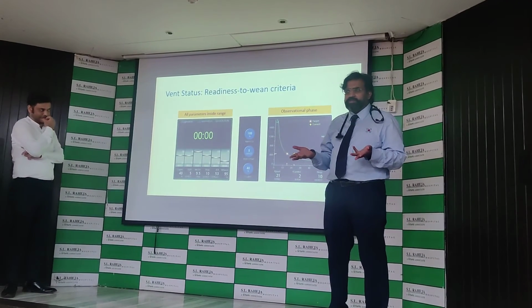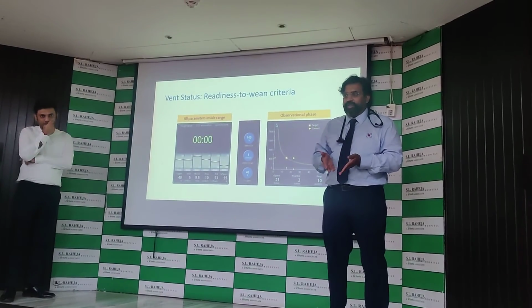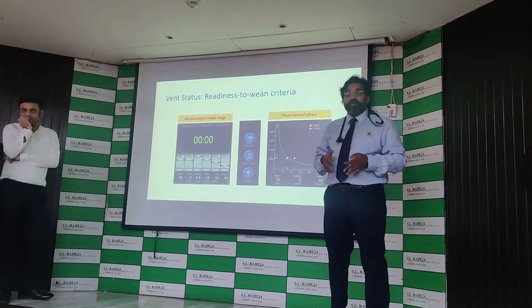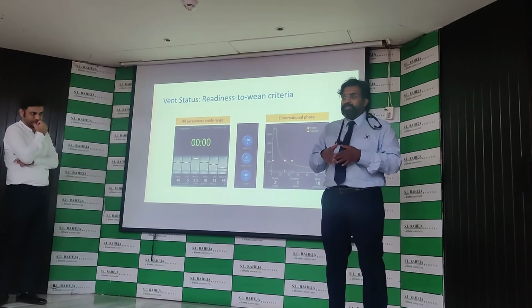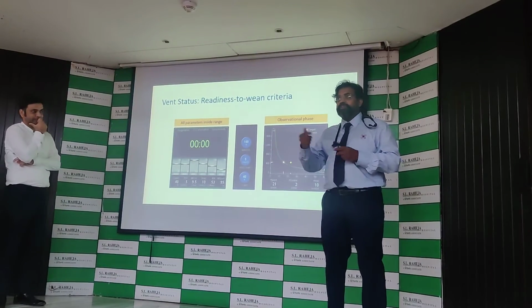Wait for some 2-3 minutes, because it is going to immediately affect the patient. You can see the difference. It's not like the patient घर में रहेगा. अगर समझ लो after another 5 to 10 minutes, patient still remains like that, you can't leave the patient. What do you do next? Increase it by another 20%.